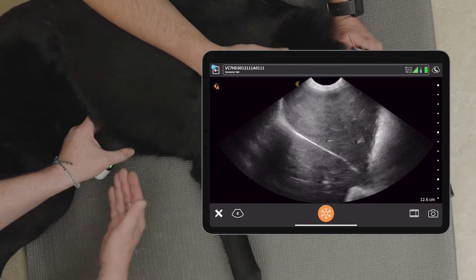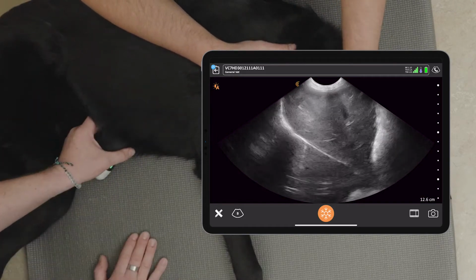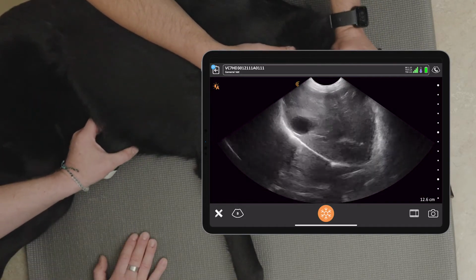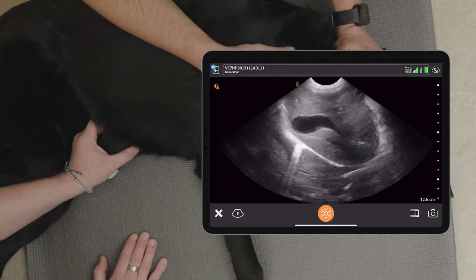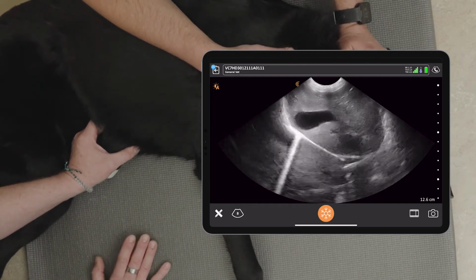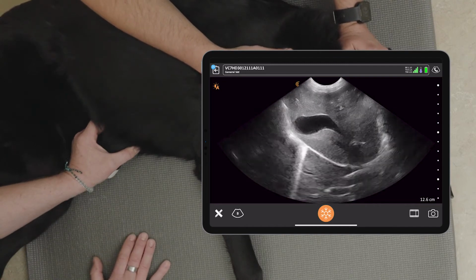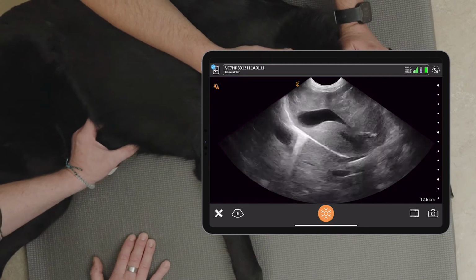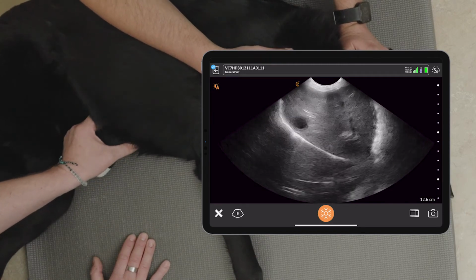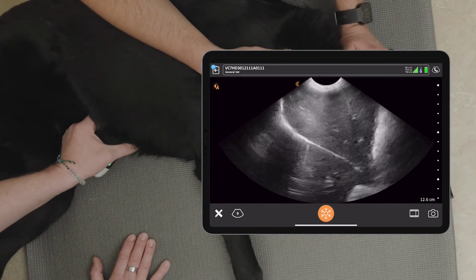The gallbladder sits just to the right of midline, so he's in left lateral, which means the gallbladder is going to be a little off the table, so we're just going to fan the probe to her right, and there you can see we pick up that gallbladder really nicely. And I look at that, Dr. Schlub, I see very thin wall. I can see that it's just barely visible. It's a white line that we can see there. Yep. But it's definitely not thickened, and I definitely don't have a halo sign. So that's the gallbladder we're going to look for there. I'll fan all the way off one side, fan all off the other side, make sure that disappears, and we'll come back and do the short axis of that at the end as well.